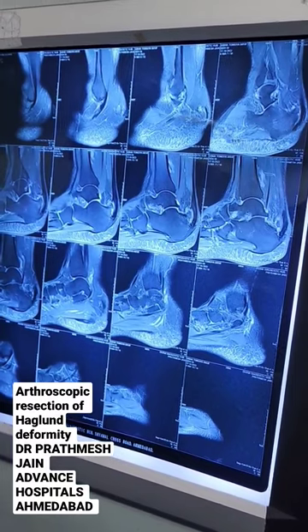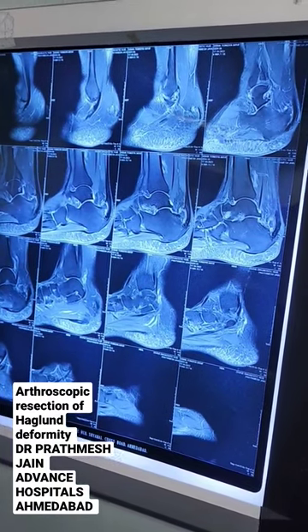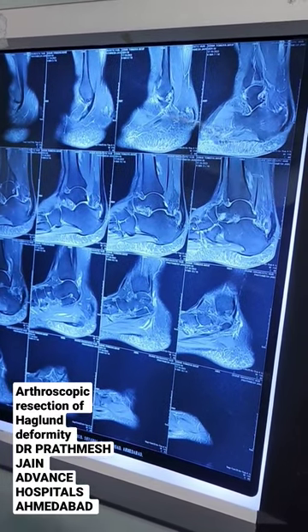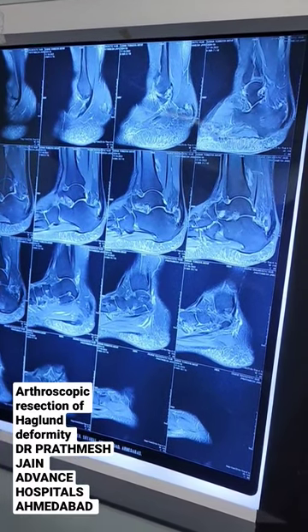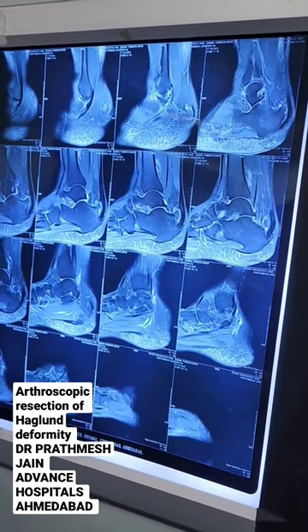This is a very classical case in which we can do a posterior ankle arthroscopy and removal of this Haglund tissue.